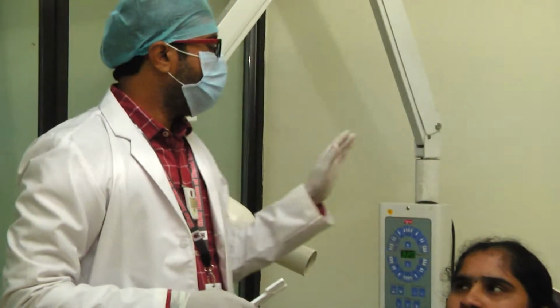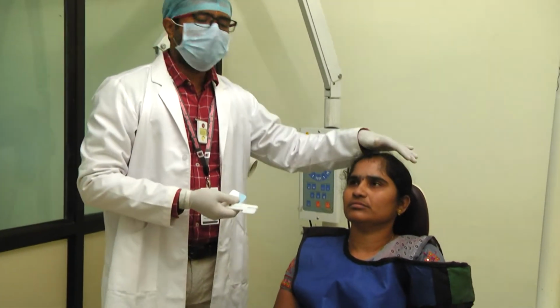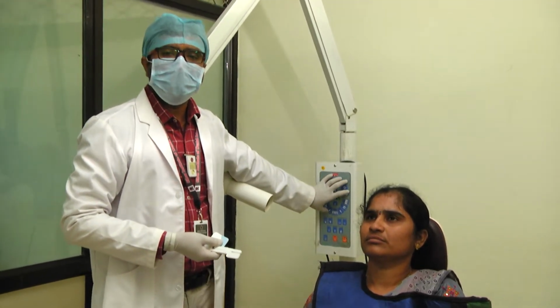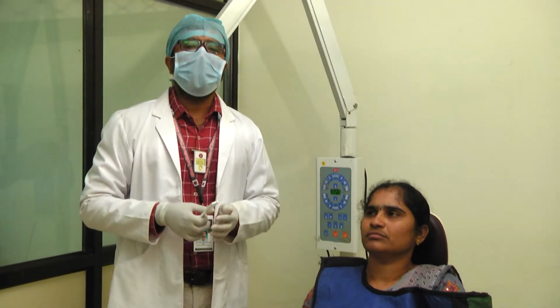And finally, position the tube head towards the area to be radiographed, and then finally expose the machine according to the preset parameters. So these are the 7 fundamental rules to be followed to make an ideal radiogram.